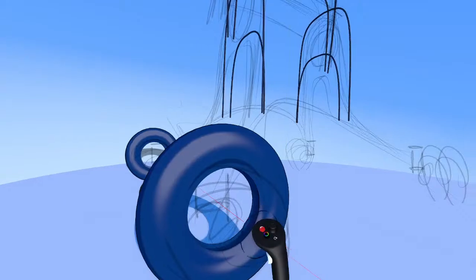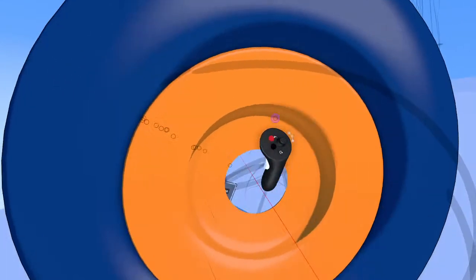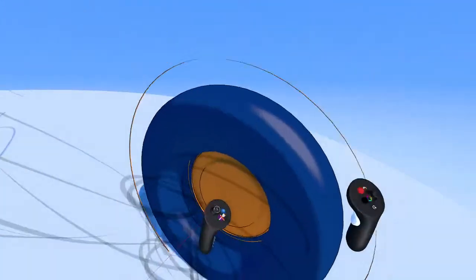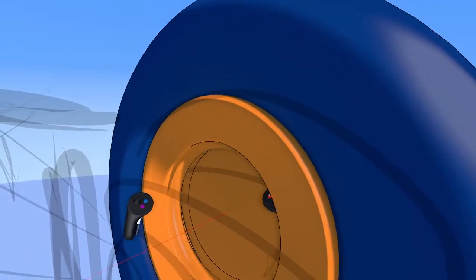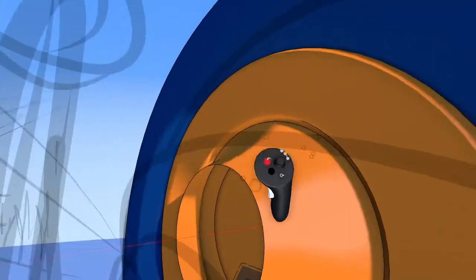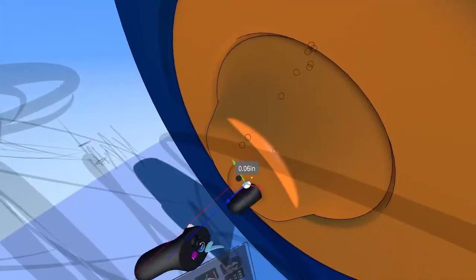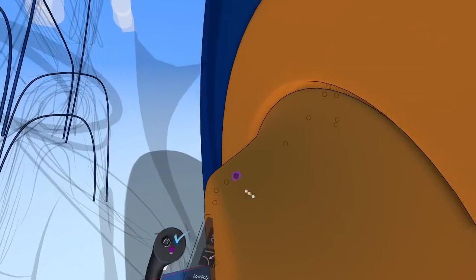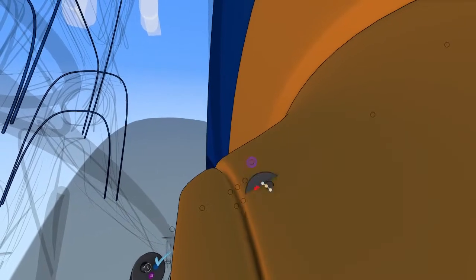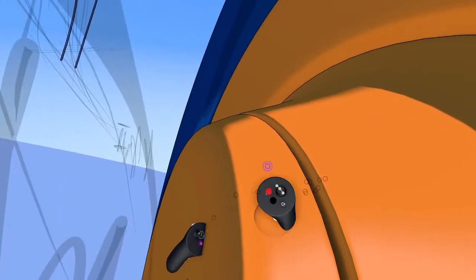I'm going to take that out of edit mode now. What I want to do is create the actual inner plastic or metal rim for it. So I usually change it to a different color just so I can separate it and see where things are touching down. And then I make the inner rim for that. All right, so we can go in and add more detail here if we want, and I kind of can't help myself from adding more detail, so I'm going to do that real quick. Okay, there we go. We have our shape.